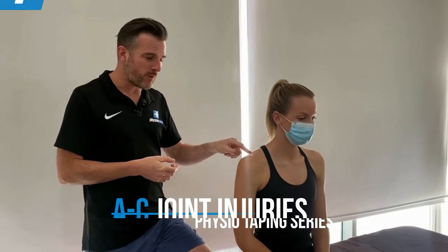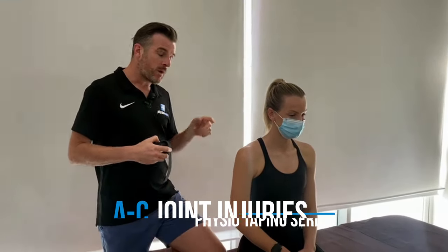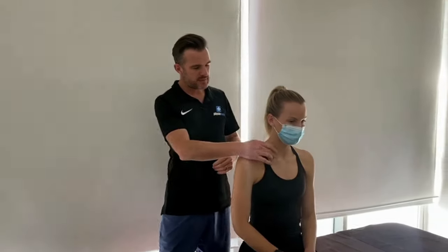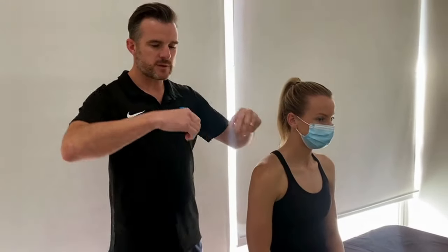Today's taping session is for the AC joint. I'm using kinesio tape and the way I tape AC joints is to stabilize the collarbone but also to unload the entire shoulder. When you have an AC joint problem, the AC joint is collarbone to acromion — so if this is your acromion, there's your collarbone, and it's that joint in between.